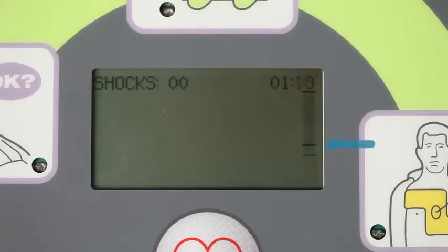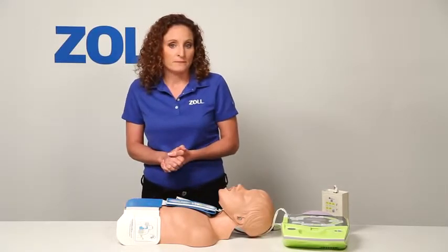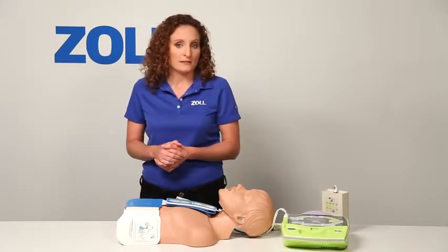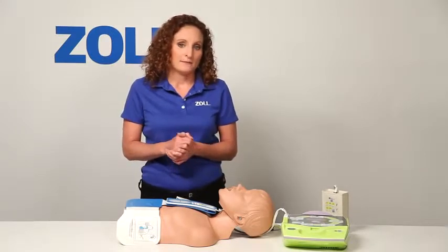The upper line represents 2 inches, while the lower line represents 2.4 inches. When you do good compressions, the bar should at least cross the upper line. Now, if I stop CPR before the AED Plus tells me to, real CPR help continues watching for my compressions. And after 10 seconds with no compressions, it will prompt me again.